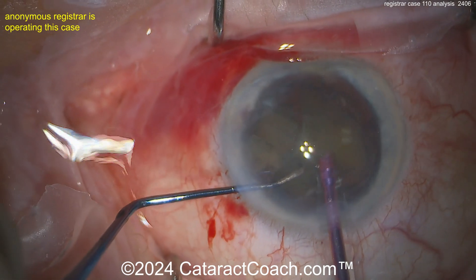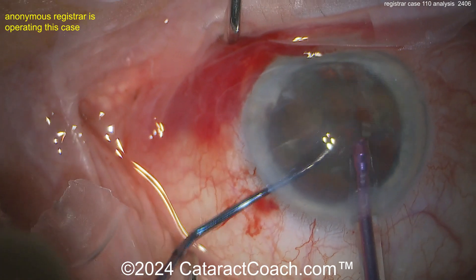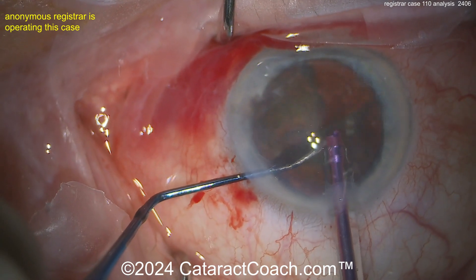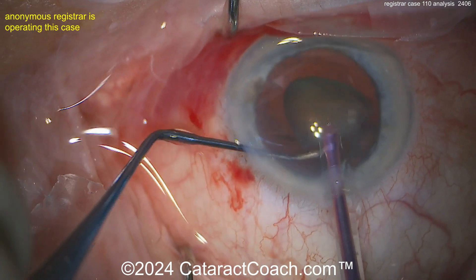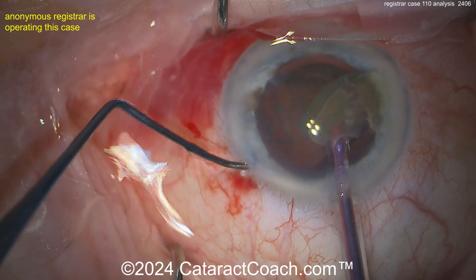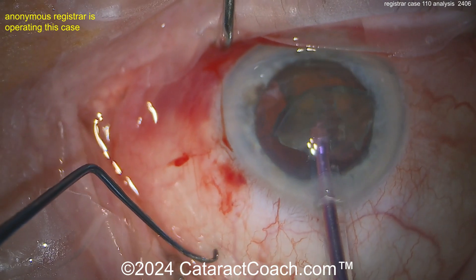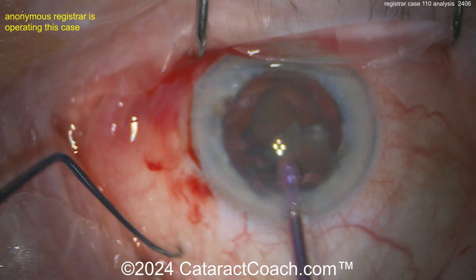Look at the AC bounce — look at the pupil. The iris bounces back and forth, back and forth. That's not good fluidics. That means you're temporarily, as you clear the port, getting a post-occlusion surge. Watch: the piece goes down, and as it goes down and the port is cleared, you'll see the iris bounce.